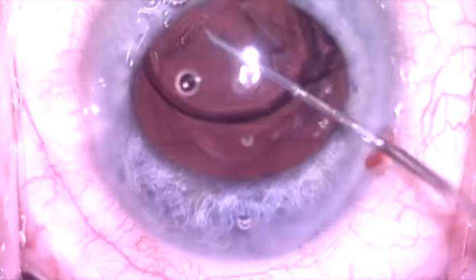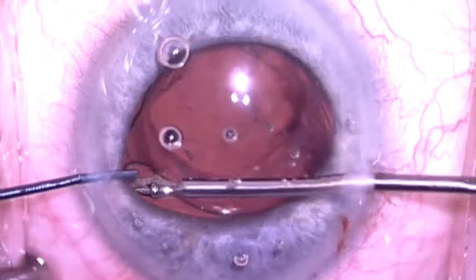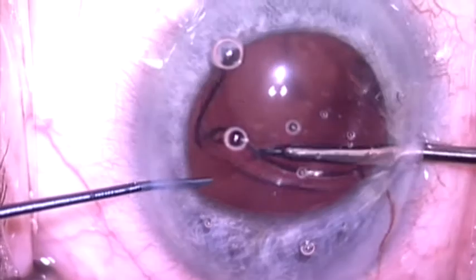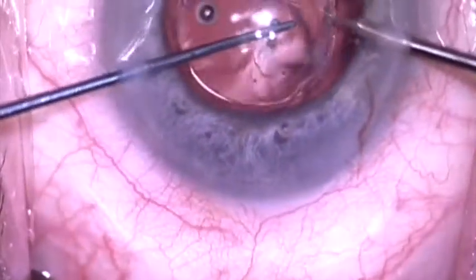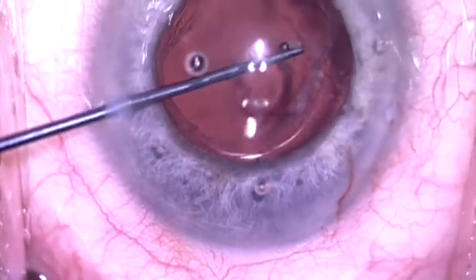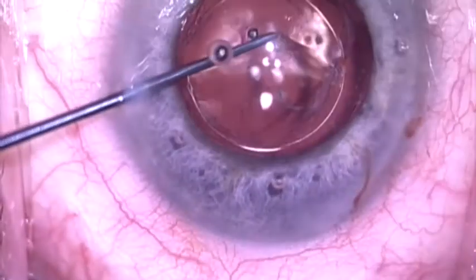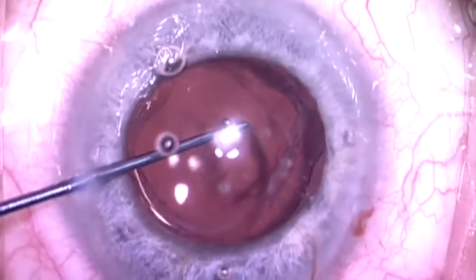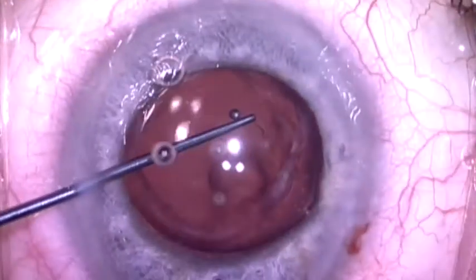So now I've worked my way around, and I'm going to try to reposition the haptic that's in the sulcus into the capsular bag. I'm able to actually achieve that, and the lens is now completely within the capsular bag and feels quite stable. I'm going to rotate it a little bit and ascertain that the lens is completely under the anterior capsule.